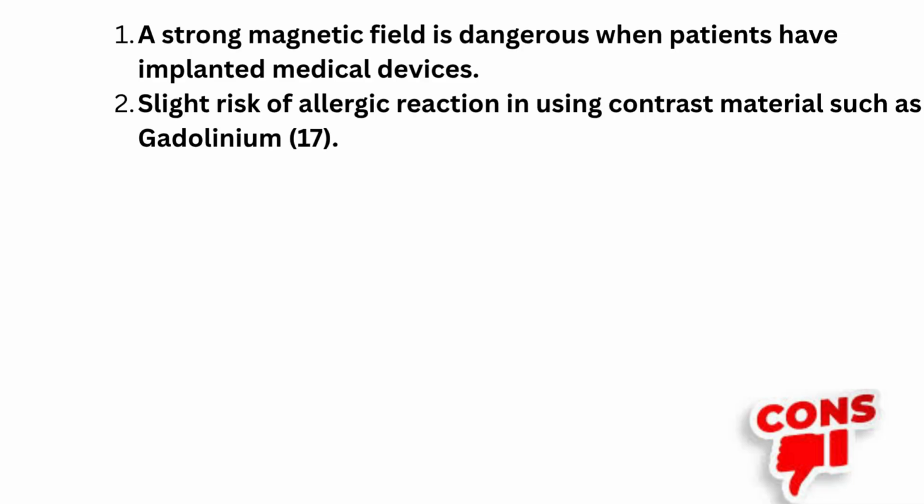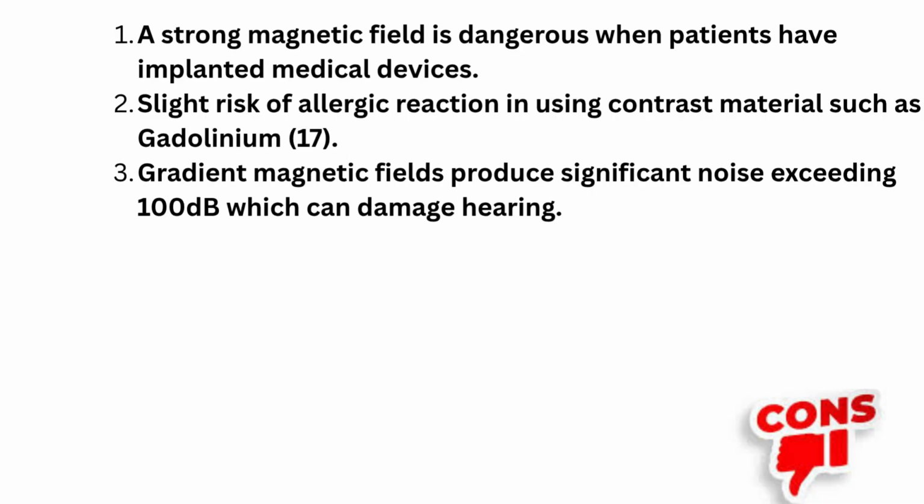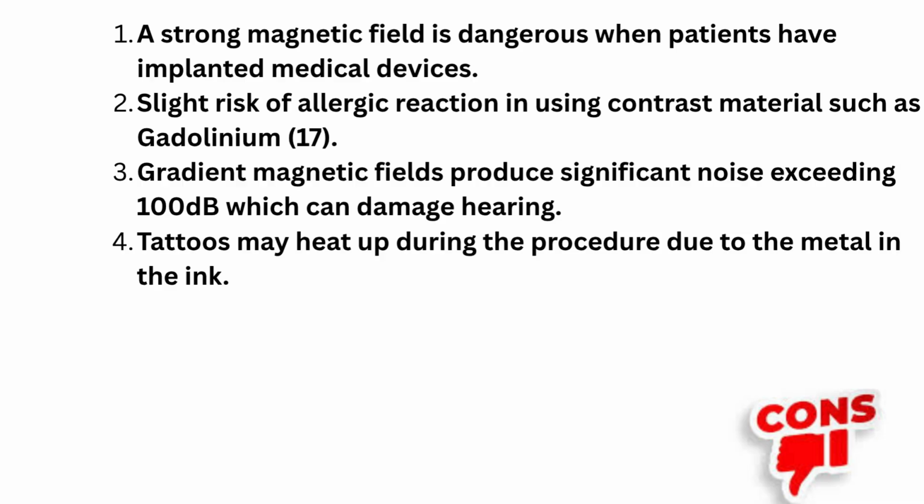There is a slight risk of allergic reaction in using contrast materials such as gadolinium. Physicians should review patients' past medical history. Non-contrast MRI is used when possible. Gradient magnetic fields produce significant noise exceeding 100 decibels, which can damage hearing. As of now, headphones are provided during the procedure, but newer machines that are a lot quieter are replacing noisy machines. Tattoos may heat up during the procedure due to the metal in the ink.